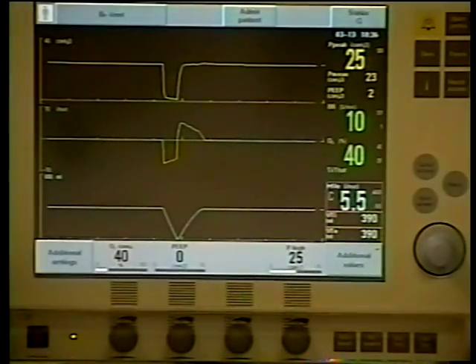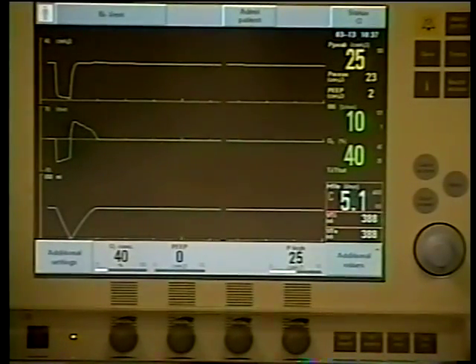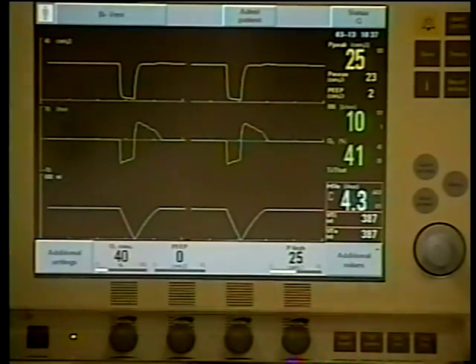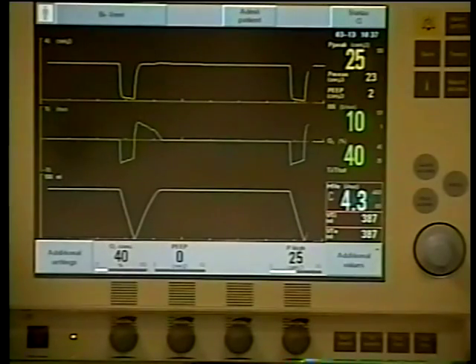Now, just a real quick thought process here. When you guys take a patient from the oscillator to conventional ventilation, you do that fairly routinely. Does the patient do well all the time? Not all the time. No, you're smiling, so I know the answer. Not all. Let's think about that. Why do we think that the patient doesn't always do well?